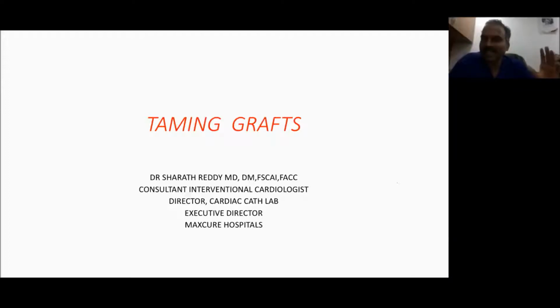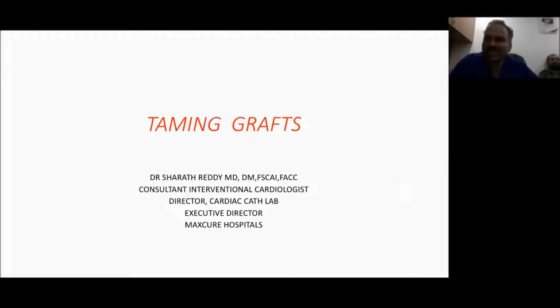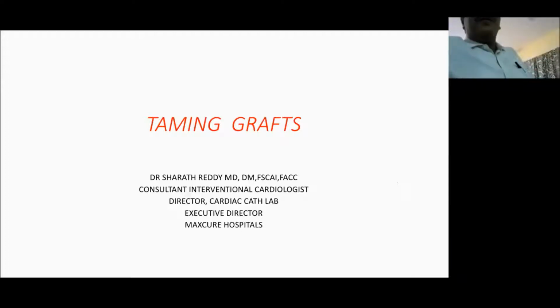And if there is a graft to OM which is very good, with no suspicion in CT angio, then I don't inject those grafts either. So in a way, it saves your time and saves contrast. In fact, that is good for the patient also, rather than playing with catheters in his ascending aorta. So CT angio is useful for a graft patient because the amount of contrast and radiation will not be more. That is an advantage.